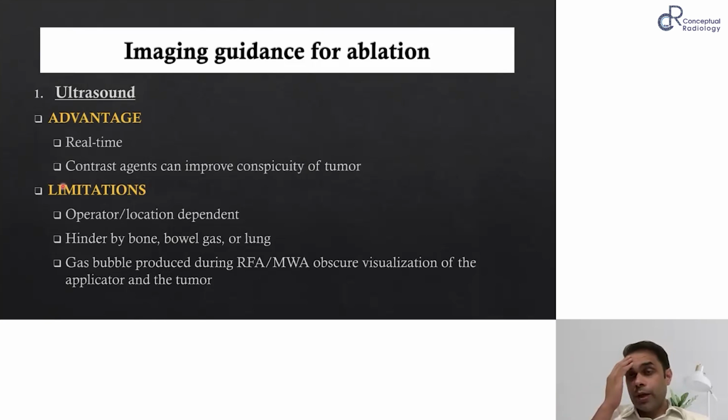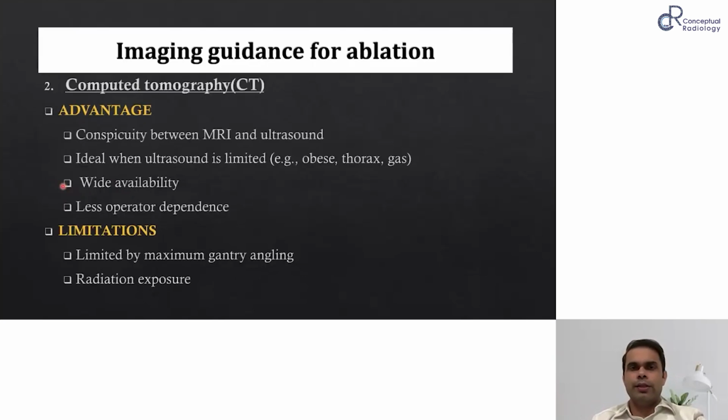When you end up creating gas bubbles during the procedure of RF or microwave, they also hinder the visualization of the tumor. You may feel that you have taken off the entire tumor, but the air bubbles may not have been the sign of actual temperature change. So later on they will go away, and you might feel that it has been taken care of. So it takes a bit of experience to understand in ultrasound how well your ablation has taken. Sometimes you have to be dependent on the fact that I've set the right time, right power, and it should take care of this size of lesion.